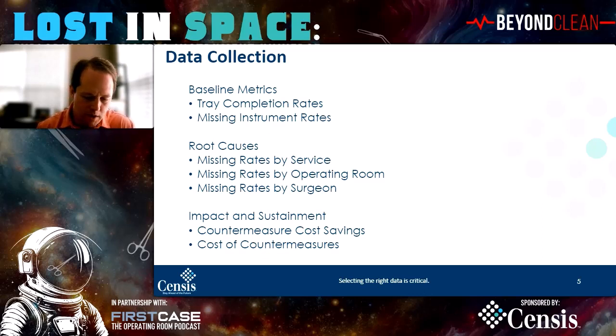The anecdotes we got are things like clips and clamps getting wrapped up in the drapes and thrown away. We talked to a number of customers who tried solutions over the years, like putting metal detectors on trash cans, or using a metal detector wand to scan the trash to see if anything was thrown away.